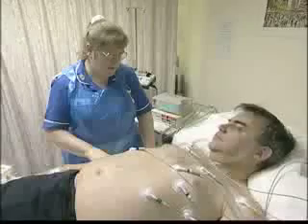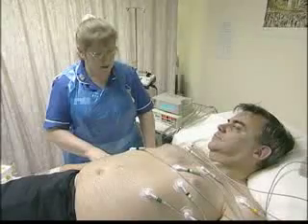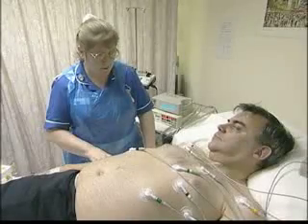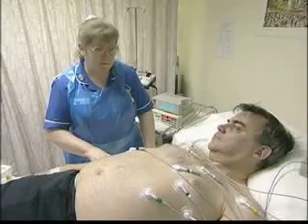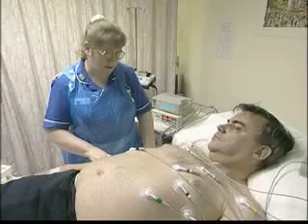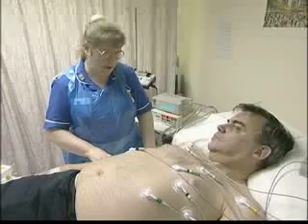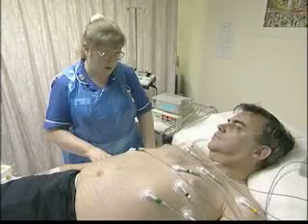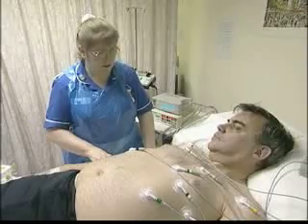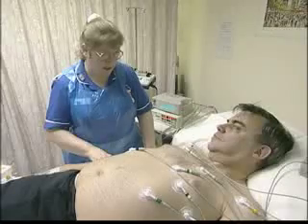That's that part of the test finished now Mr Park. I'm just going to disconnect you from all of the machinery and then I'm going to ask you to wait in the waiting room, because it takes this isotope up to an hour to reach your heart. Then I'll come and collect you and escort you through for your scan.